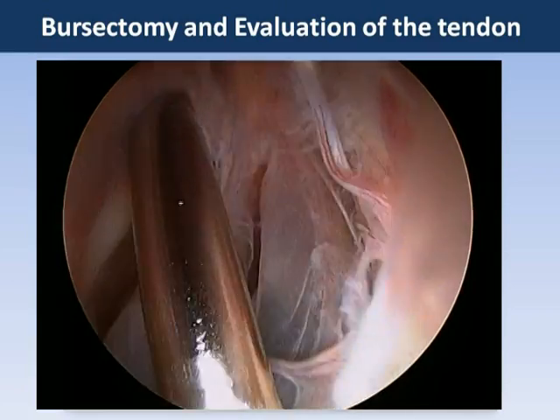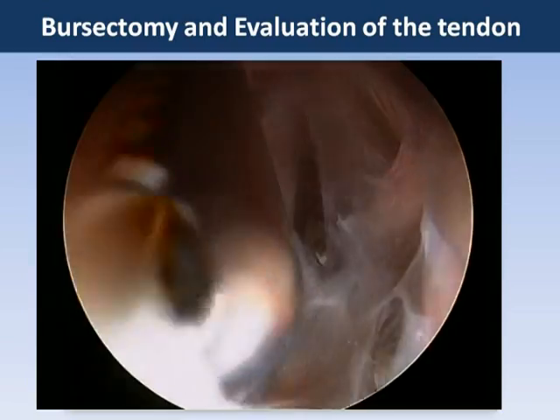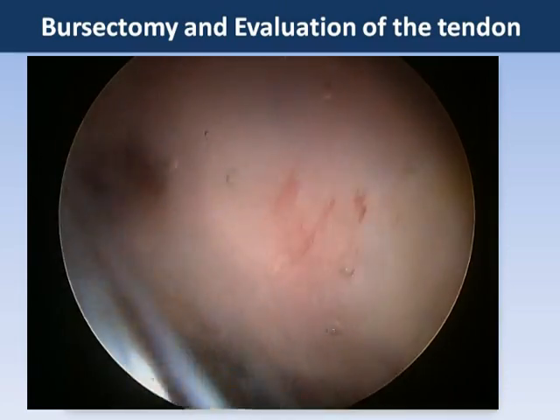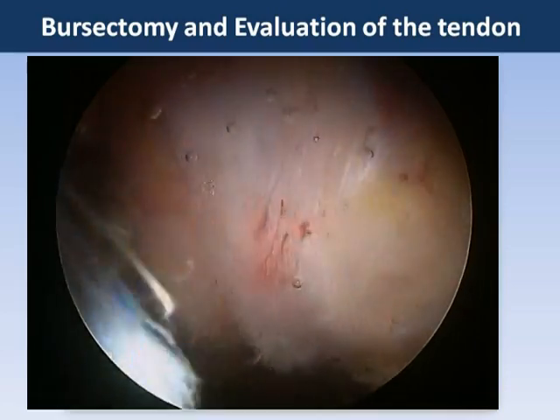This is the shaver being used in the peritrochanteric space to perform a trochanteric bursectomy. The majority of the bursa is excised and we examine the gluteus medius muscle belly and tendon insertion at this point using the probe, and we can get a clue that there is an undersurface tear here.